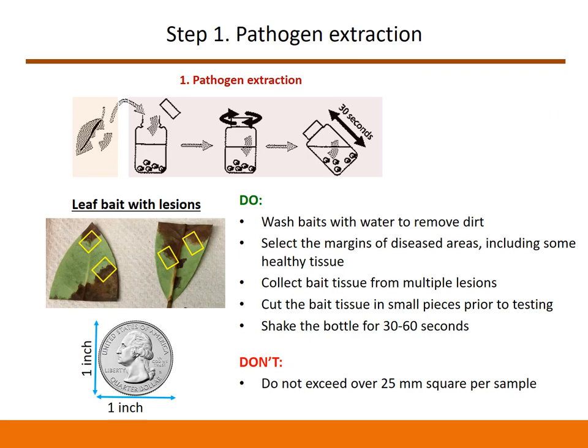While this kit can be used to test symptomatic leaves, roots and stem tissue, we are going to focus on testing leaf baits. It is a three-step process and these steps also apply to other tissue types. The first step is pathogen extraction. Make sure to collect from the edges of the diseased area as shown in the yellow boxes. Cut the bait tissue into small pieces. If you have two leaf baits from the same sample, use a small portion of bait tissue from both leaves. Make sure the bait tissue collected does not exceed 25 mm square, which is roughly equal to the size of a quarter. Once you add the bait tissue to the extraction buffer, close the lid tight and vigorously shake the bottle for 30 to 60 seconds to crush the tissue.